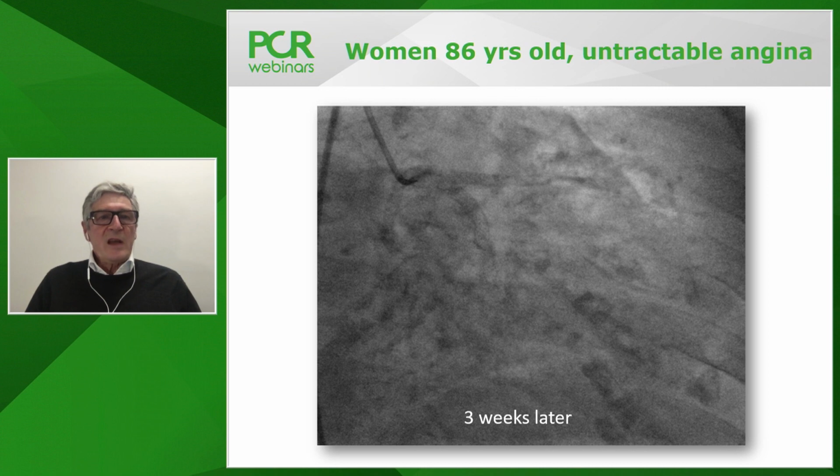The only problem is the time of inflation, which is at least 15 seconds, because you have 10 seconds of inflation. So, of course, you can give some waves in less time, but you need to do a lot of inflations and then a few activations. But I think it's a very useful tool in this kind of lesion, if necessary.